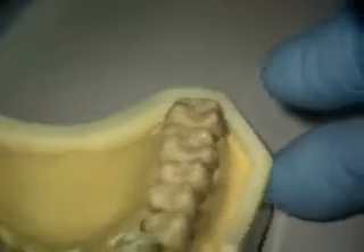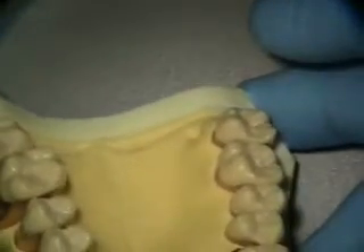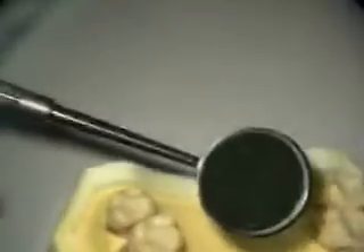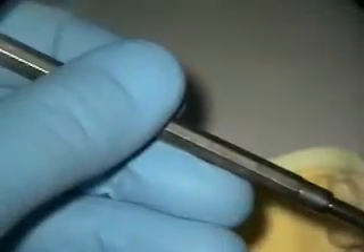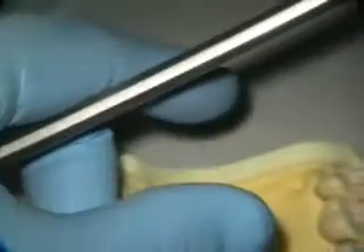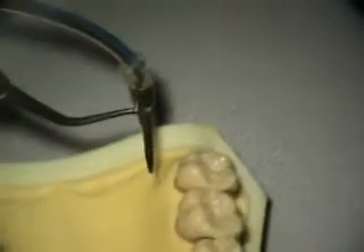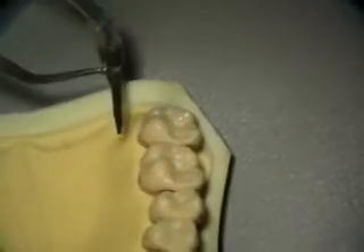Then I'm going to position my patient more to the right. What I do with the mirror is — I'm holding the mirror, I just flip it down and I pick up the endoscope. So I have the endoscope in one hand and the mirror in this hand too, just holding on to it down here. That way when I put the endoscope down, I have the mirror right there and I just flip it.